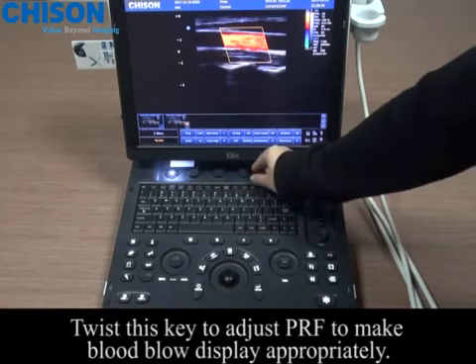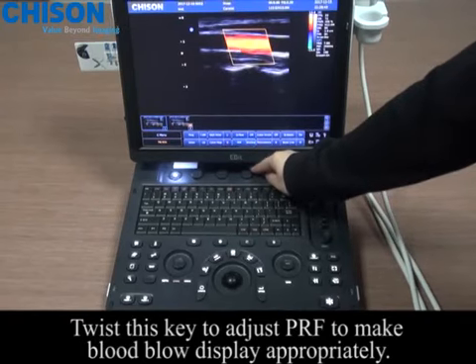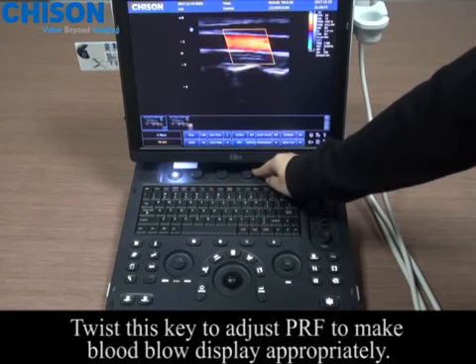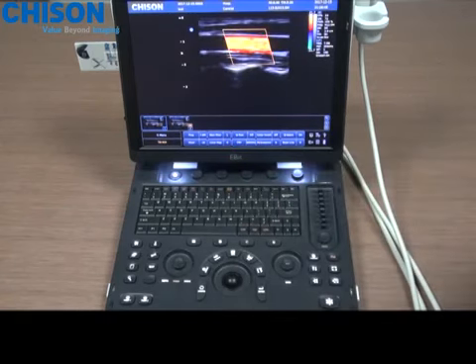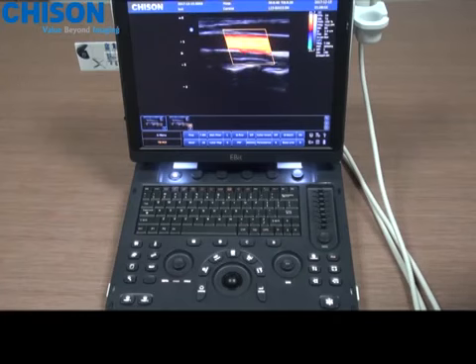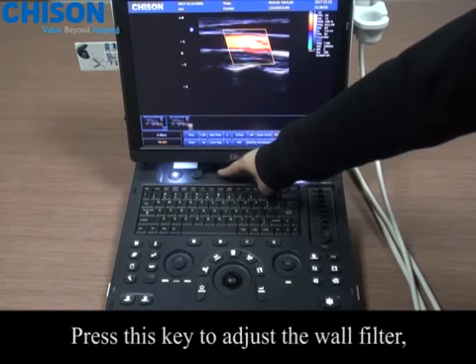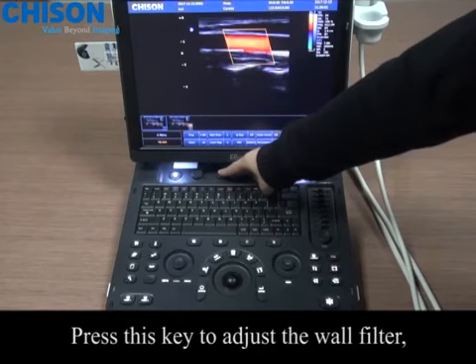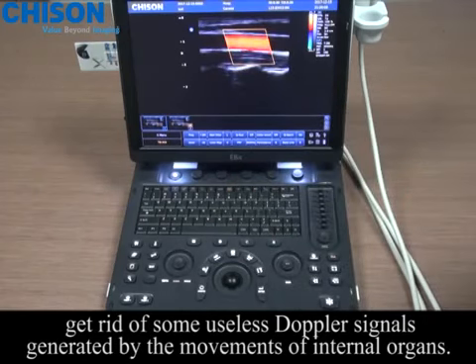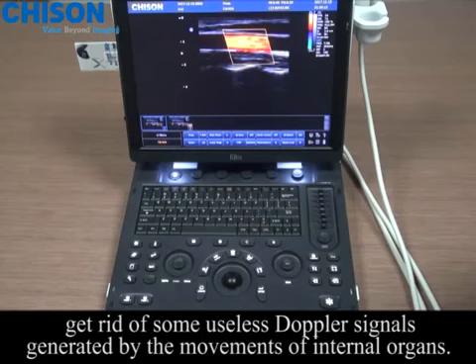So that the blood flow will not exit the vessel or disappear from the vessel. Twist this key to adjust PRF to make blood flow display appropriately. Press this key to adjust the wall filter to get rid of some useless Doppler signals generated by the movements of internal organs.